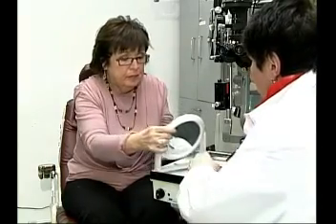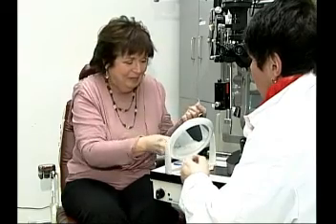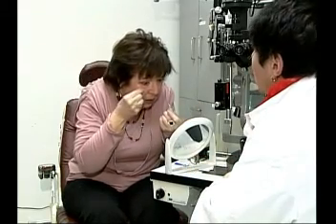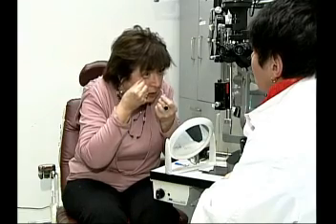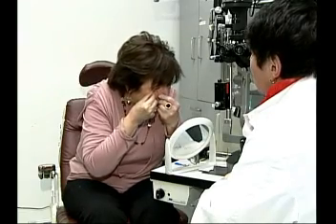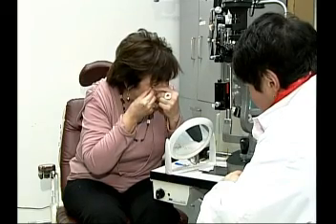Again, just like wearing contact lenses for the first time, for some people it takes a little getting used to. Be sure to carefully read the instructions provided and, if possible, practice inserting your Lacrisert while still in your doctor's office. If improperly placed, Lacrisert may result in a corneal abrasion. It's really not difficult, and a lot of people say, "Oh, doesn't that hurt?" And it really doesn't hurt. You don't even feel it.